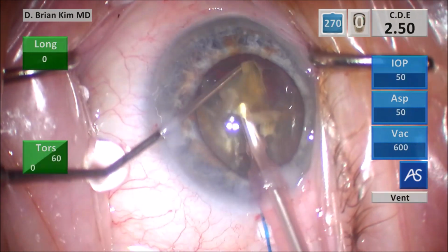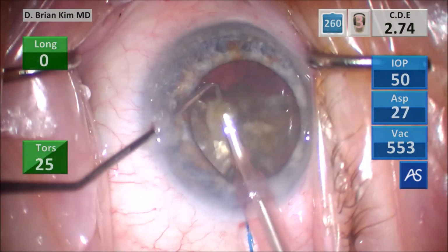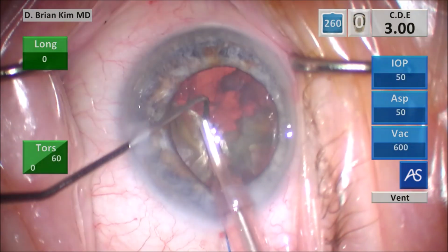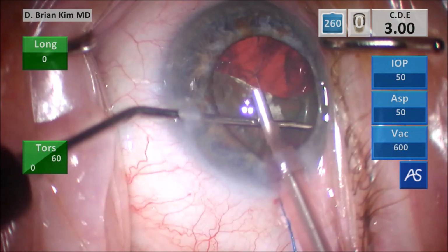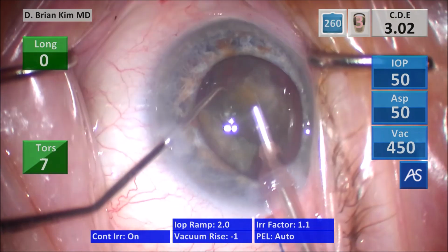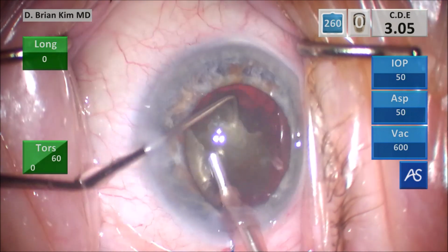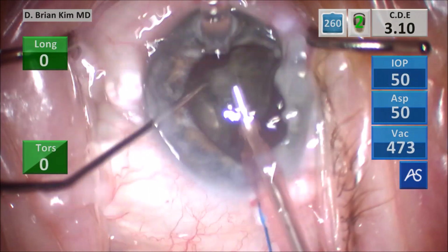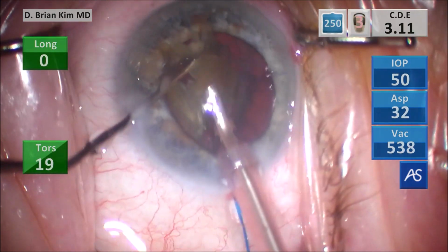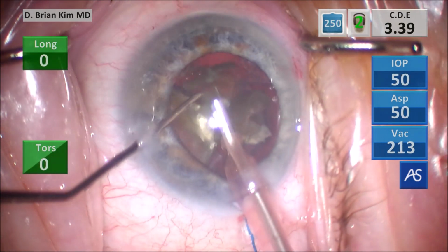the lens pieces. This is a really dense lens, but you can see that iris is stone cold stable, no iris prolapse whatsoever. So I'm trying to get around that one fragment. It's kind of turning on me. Trying to use a little bit of vacuum. And then I placed the chopper around the lens piece. I was able to cut it in half there. And then I'm slowly removing those small fragments.